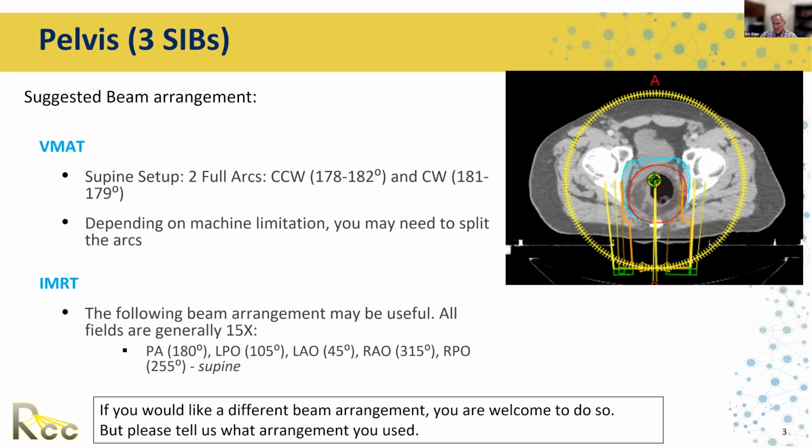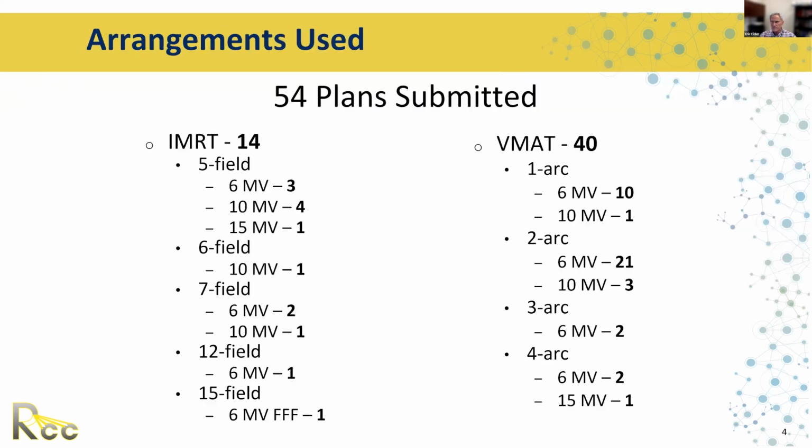It was using 15 MV, and that's not something we typically would do for IMRT at Emory. The concern with using an energy greater than 10 MV, of course, is the neutron dose that the patient would receive. So we would generally not do that. That being said, I did construct an IMRT field using 15 MV, and it worked fine, but we would not use that on a patient because of the neutron dose that comes along with that.